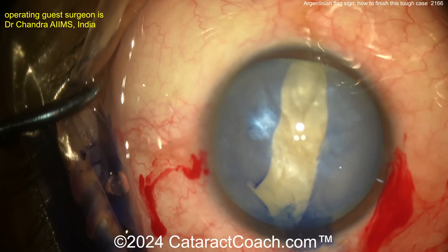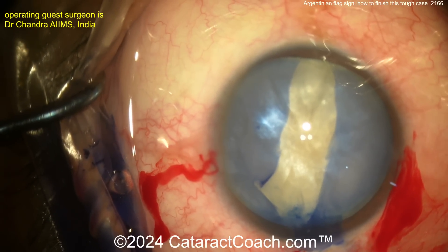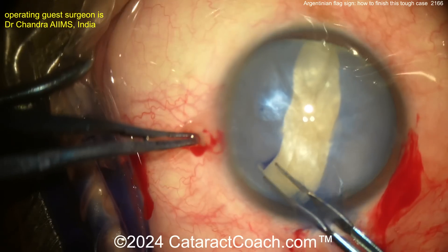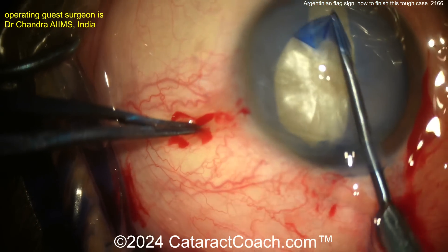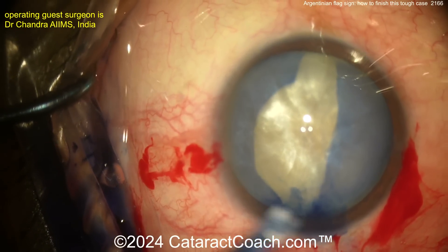What's the danger here? The danger is that tear — you think it stopped at the lens equator, you hope it stopped there. But it can zip all the way back to the posterior capsule. Now trying to get at least a half rhexis done on this side, maybe do the same on the other side, so you have a reasonable opening.